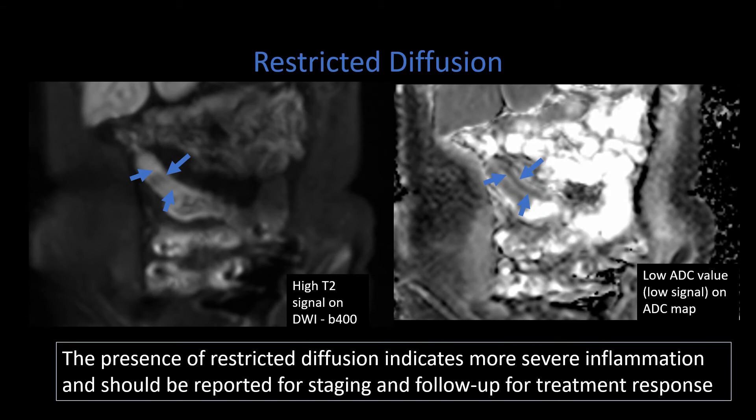You can also see restricted diffusion. There has been a lot of research on using restricted diffusion to grade the degree of inflammation. We can see here a region of active inflammation in the distal ileum, with high signal on high B-value DWI imaging within the bowel wall corresponding to low signal on the ADC map.